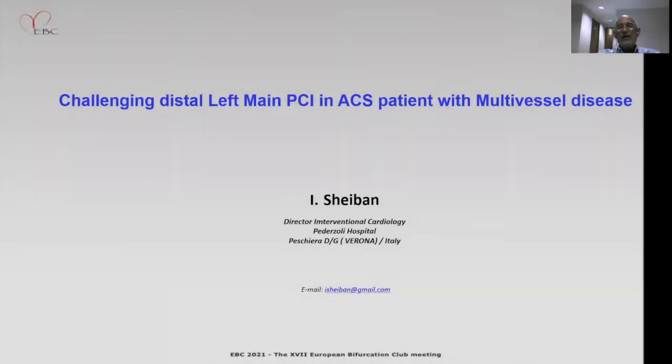Dear Chairman, thank you for the invitation to present at EBC 2021. Today, I'm sharing with you a challenging case of distal left main angioplasty in an acute coronary syndrome patient with multivessel disease.